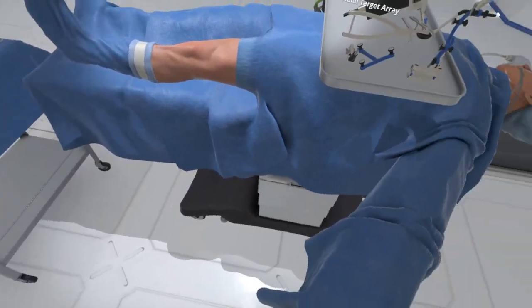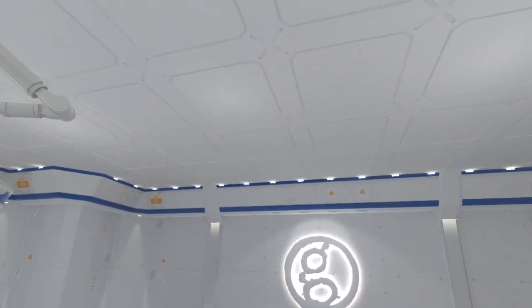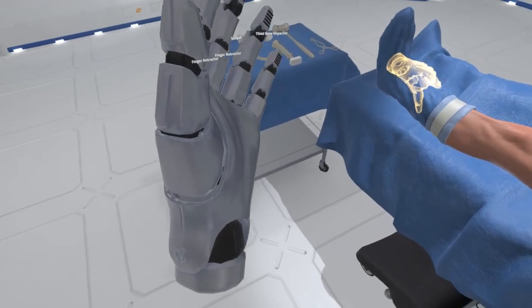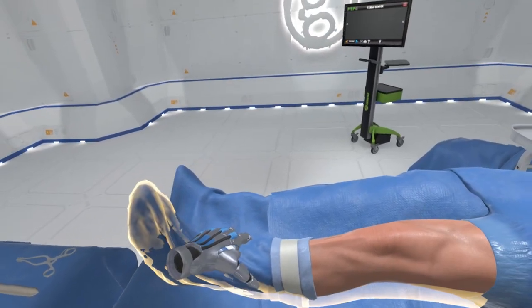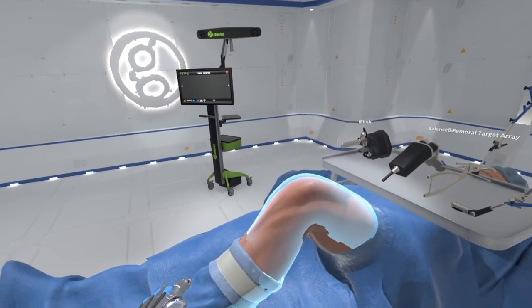Welcome to Wraith, Virtual Medical Training Simulator. In this simulation we will be performing a total knee replacement surgery. Grasp the patient's left ankle, preferably with your left hand. Good, now manipulate the leg to reposition the knee into 90 degrees of flexion.